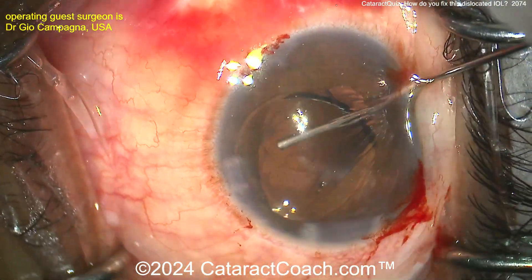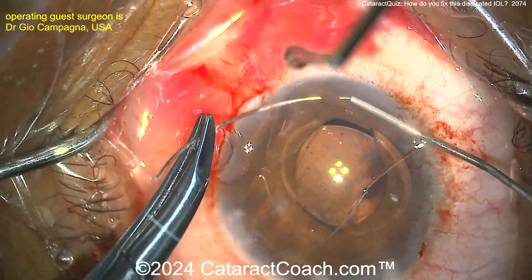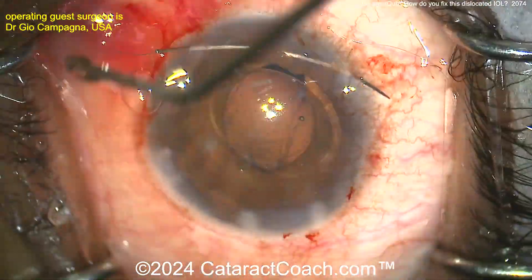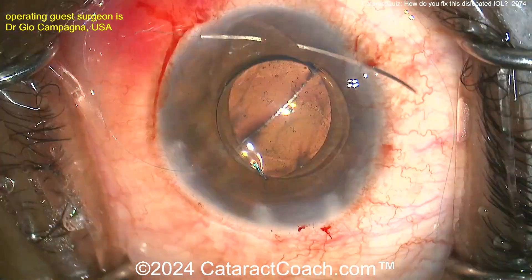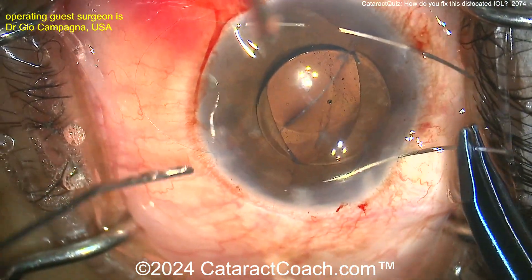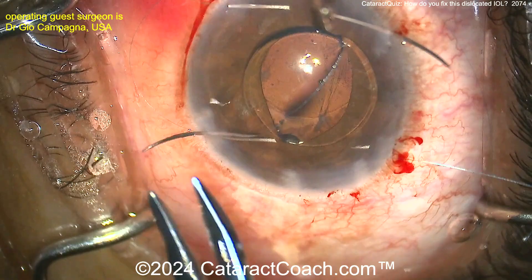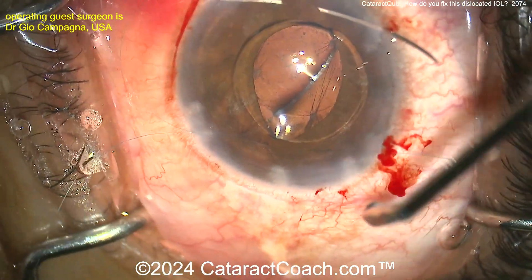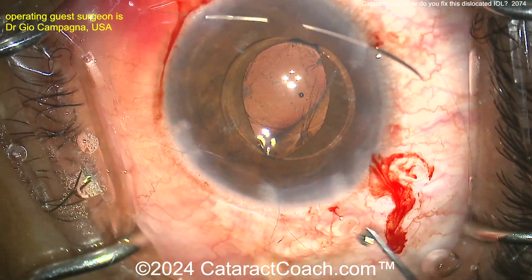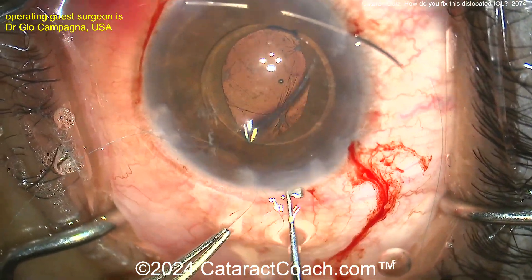Too much stress on that poor little iris tissue and that poor 10-0 prolene. This patient has sufficient or reasonable capsular support, so these sutures to the iris — think of it as like a belt and suspenders, just an extra bit of safety. Here's that 10-0 prolene on that long CIF-4 needle, pushing it through. Make sure you get good iris bites — don't get a wimpy bite, but don't go too close to the pupil margin either. You want to go mid-stroma, just about like this — this is very nicely done. Here are the two suture ends; you can bring those out and tie it up.